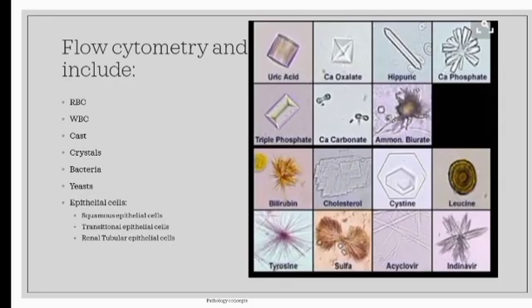I will describe some of the crystals here. First is uric acid crystal. Uric acid crystals are rhombic diamond shape, elongated, and needle shape. They can appear yellow, brown, or orange according to the pH of the urine. They are seen in gout, dehydration, renal stone, renal disease with high purine diet in acidic urine.